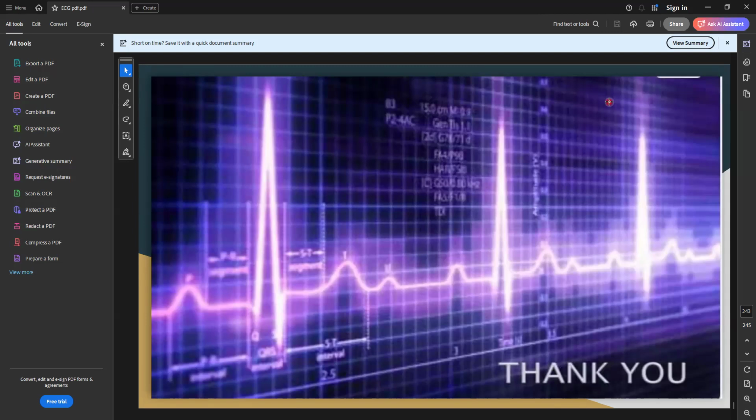See, nowadays we have started in the emergency room the FAST scan. Immediately when the patient presents to the emergency ward, you will connect the patient to all the parameters and take the ECG. If you have any doubt, you have to do an immediate echo of the patient. We call this the FAST scan.